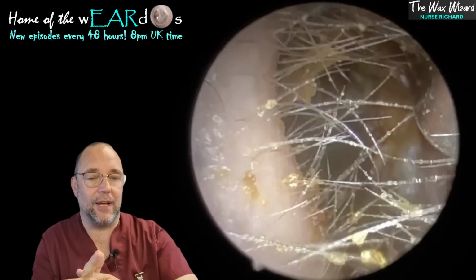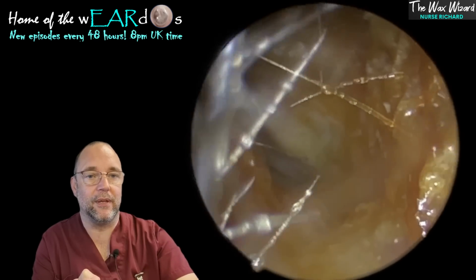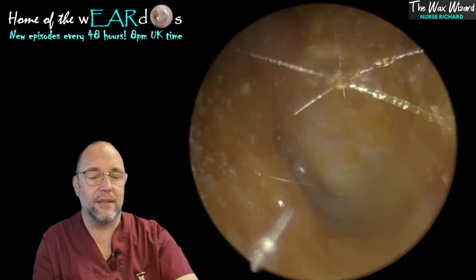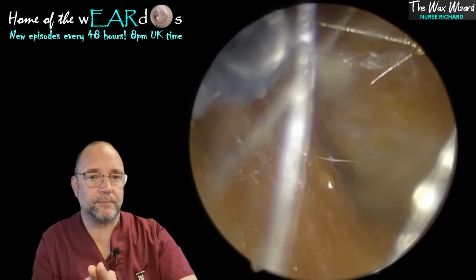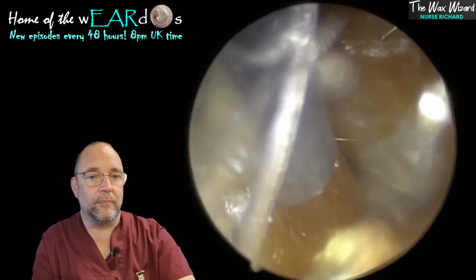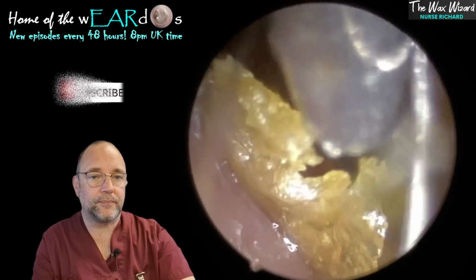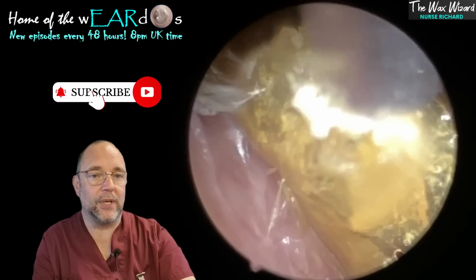It does get clearer after we get the more lateral stuff out there. And here we go, we're going inside the ear now, and you can just see this really thick layer. I've already put some oil in, and just from experience from seeing him a few times now, I know that it's not going to come away very easily unless you really oil it well when you get to this stage. Otherwise, it's just not going to peel off the ear canal.